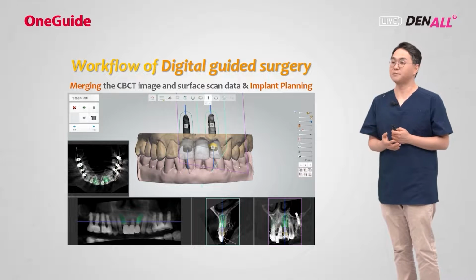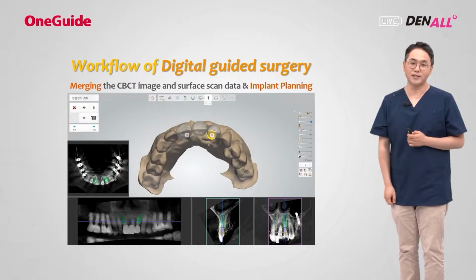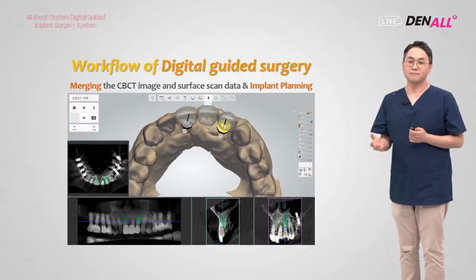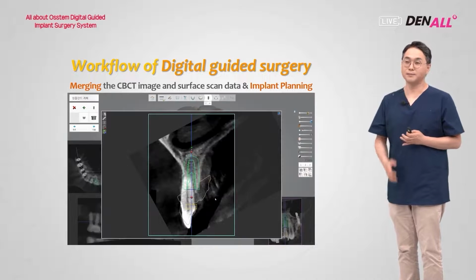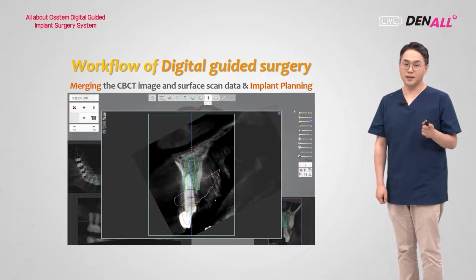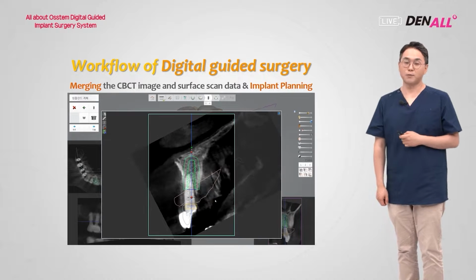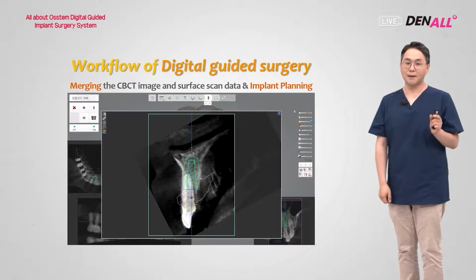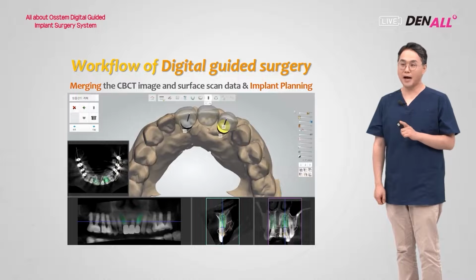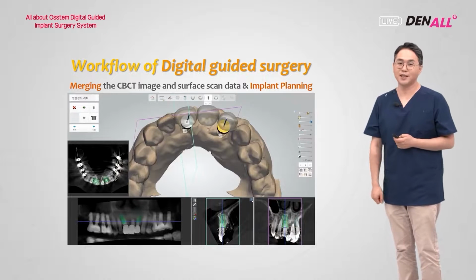If you place the implant like this, you need to choose whether this is going to be screw retained, or if the screw access hole goes labially, you can choose the cement retained type. You can predict ahead. On CT, you can check whether there is a bone defect or whether the buccal wall is thin or not. You can also adjust the implant angle or position.